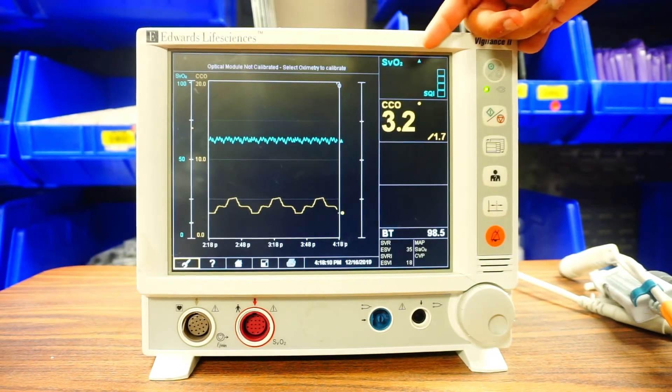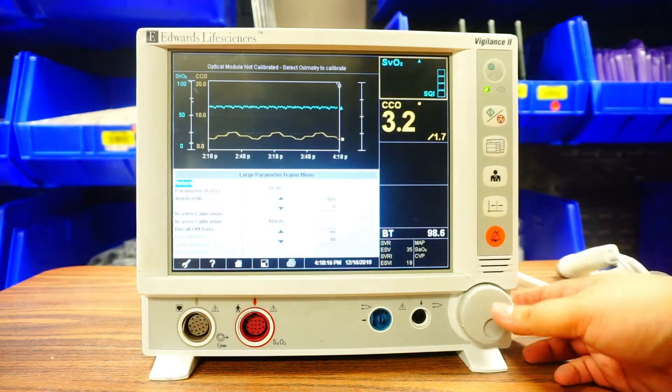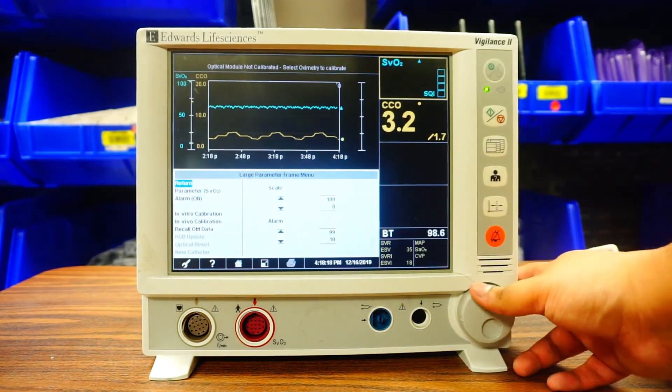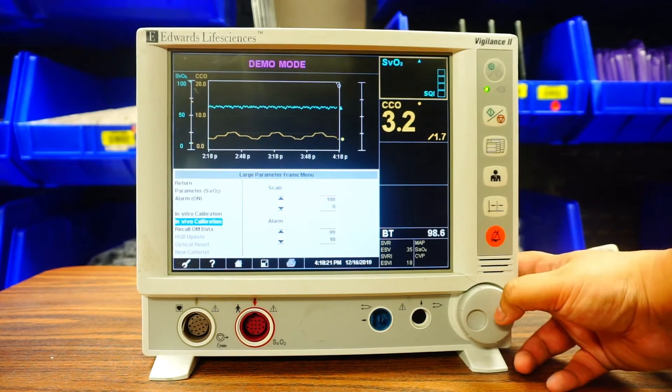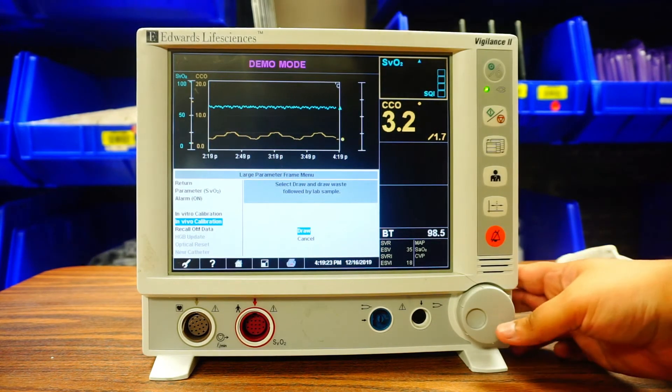Now I'll show you how to get your SVO2. Toggle over to where your SVO2 is and click it. Then go down to In Vivo Calibration and click it. It's going to do a baseline setup for 25 seconds. At this point, get your VBG syringe from your RT — they'll be ready to draw the VBG. You'll be drawing from the yellow port on your SWAN and give them the blood. The next screen will confirm that you drew the blood — press Draw Now.